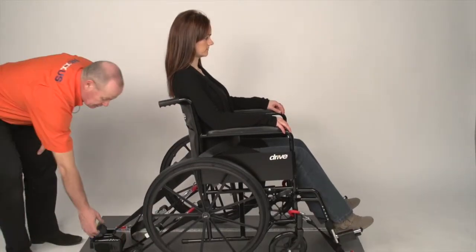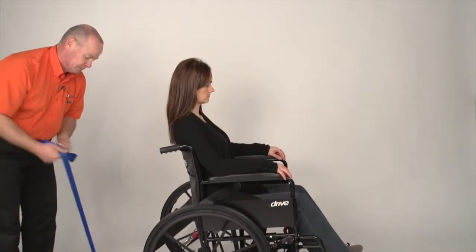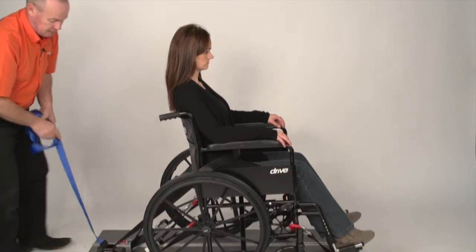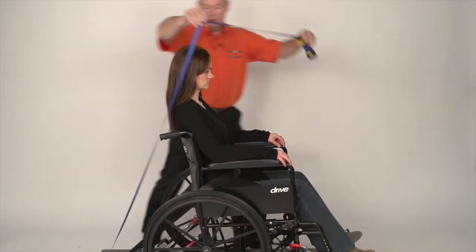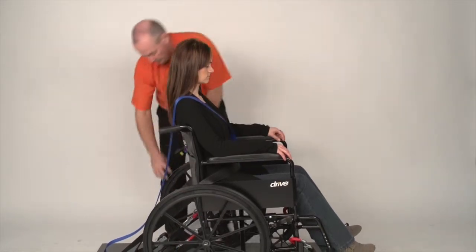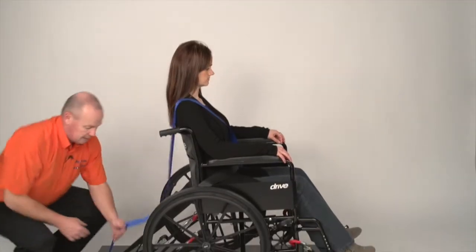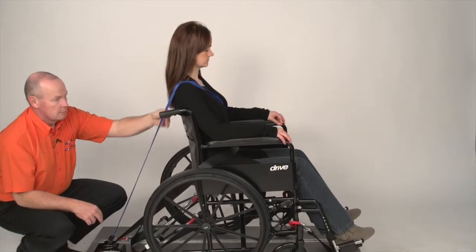Come to the rear, take the blue webbing and pull it all the way out of the reel. Squeeze the clunk clip on to stop it retracting back into the reel. Place the webbing over the shoulder and underneath the arm. Take hold of the webbing, release the clunk clip, and bring it down on the shoulder.